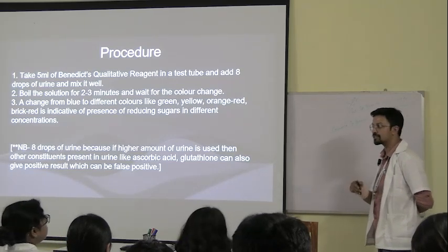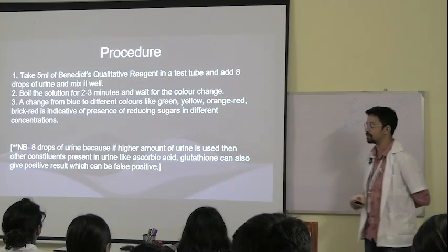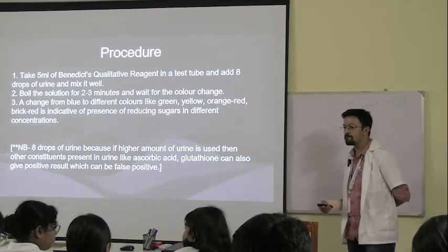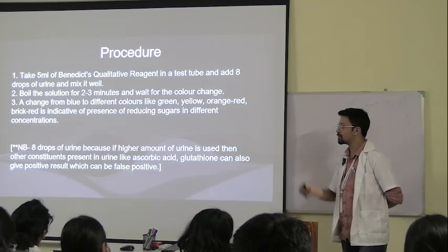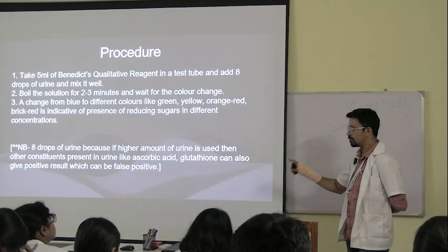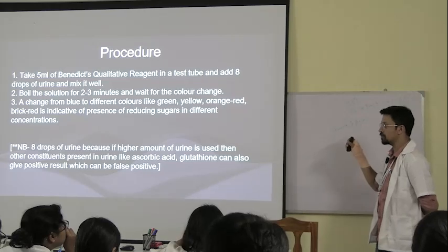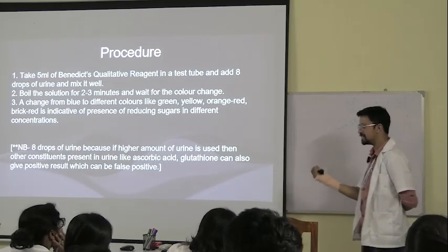And somebody asked in my last class, why sir only 5 ml of Benedict's reagent? Why not more than 5 ml? Why not 6 ml? So this is a titration. It has already been tested and titrated. Let's say you take a glass of water and you add 1 pinch of salt in it. In another glass you take the same amount of water and you add 2 pinches of salt. Which one has more? Which titration is more? The second one, clearly, that is the easy concept.